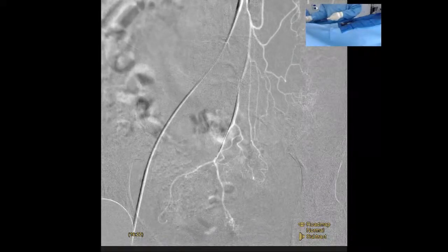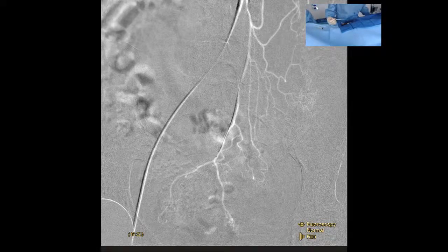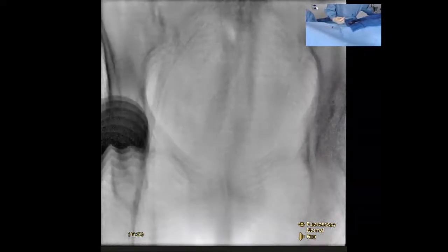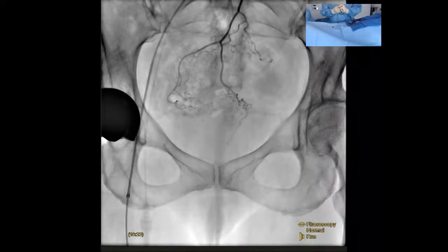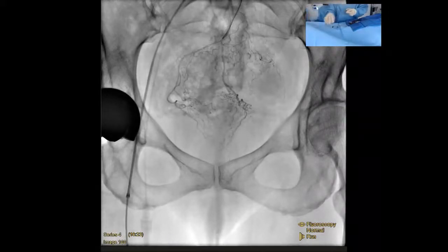Your experience with 2.0 catheters and this wire, tell us a little bit about this wire and why you like this one. Yeah, Fathom tends to be my first choice of wires. The reason is the shapeability of the tip and the ability to reshape it. You can give it a custom shape, and if the situation changes or you're headed into a different branch that needs a different shape on the tip of the wire, you can reshape it. Right. I appreciate that a lot.